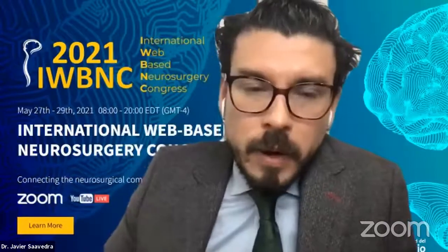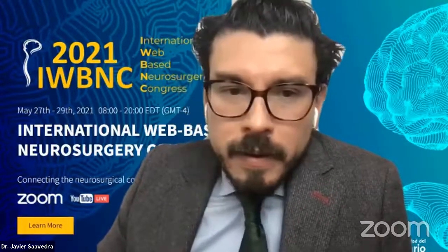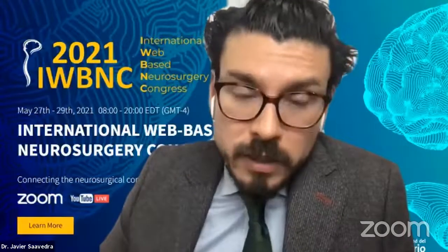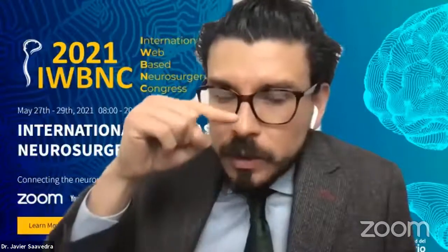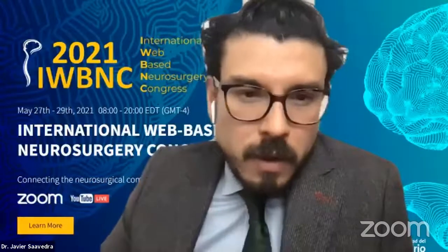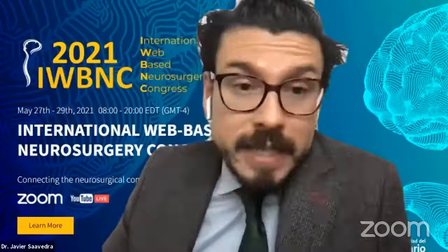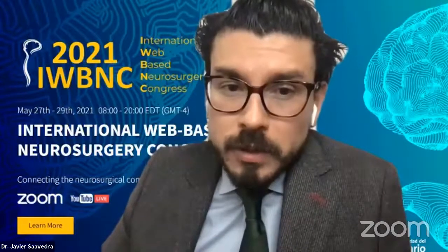Okay, perfect. The next one asks, what is the advantage that a TONES through a medial orbital wall would provide over an extended transnasal approach? Well, there's very little experience in this approach, the medial orbital. I will tell you a personal experience with a friend, a fellow at Cornell, Dr. Mina Gerges, who published an amazing article on the anatomy of the infratemporal fossa through TONES. He had the nice idea of addressing lesions of the lateral recess of the sphenoid sinus through a pre-caruncular approach. We performed anatomic cadaveric dissections, and it turned out to be very useful. But apart from that, there's not much more experience.